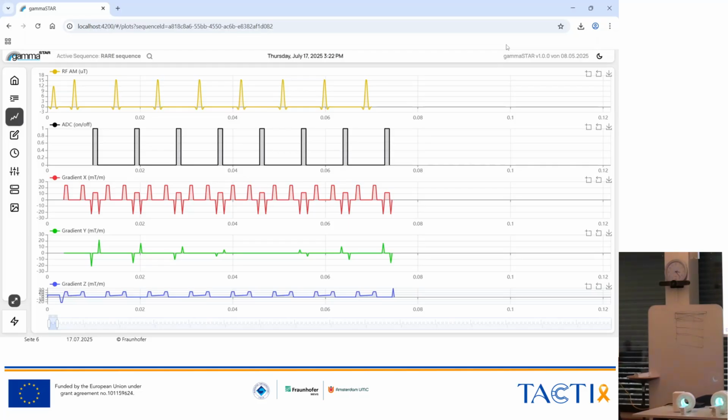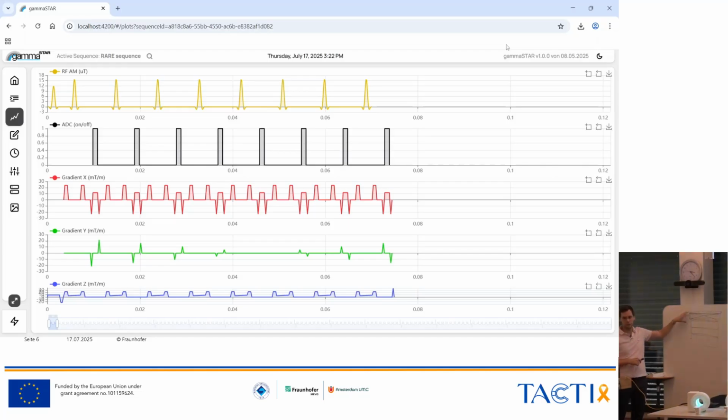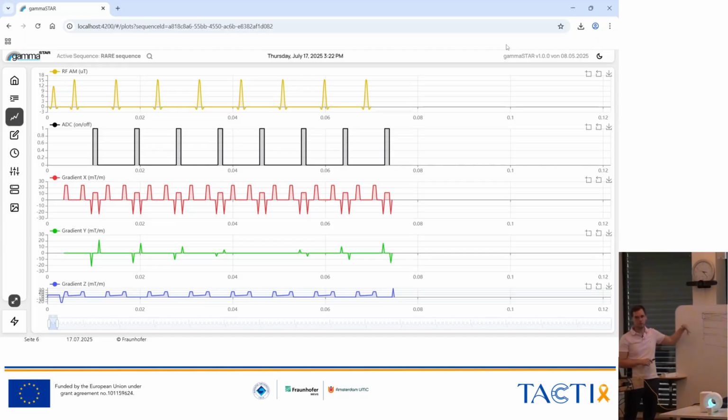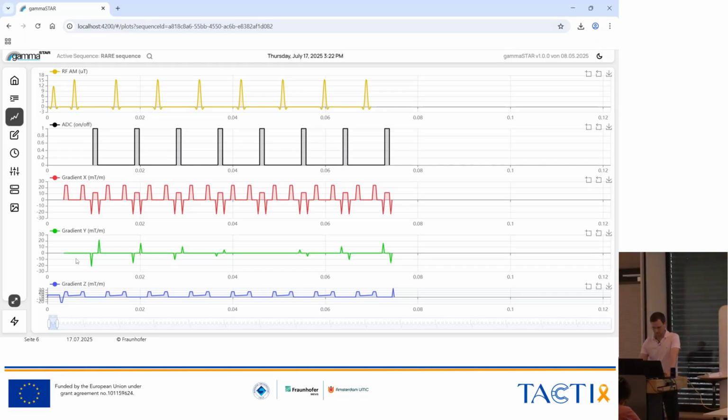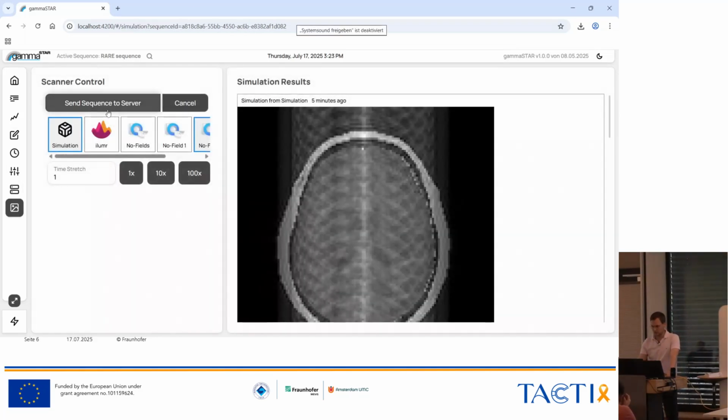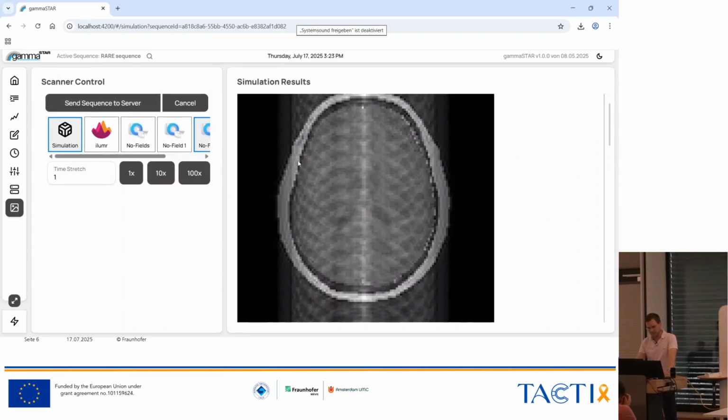And this very much reduces the maximum frequency intensity jumps in the K-space, smoothing out the signal through K-space, getting rid of the ghosts, and let's say smearing the intensity differences throughout the K-space, resulting in hopefully nicely looking images, but there is something going on here. So if you followed along, you also see that on your devices. Any idea why this would happen?